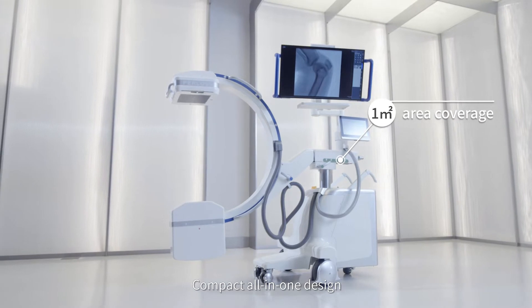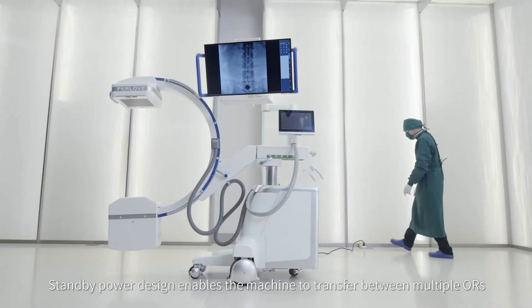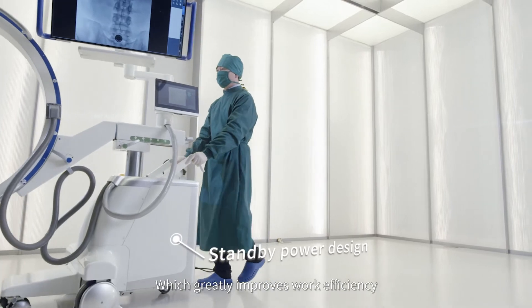Compact all-in-one design with a smaller footprint, easy for operation. Standby power design enables the machine to transfer between multiple ORs, which greatly improves work efficiency.